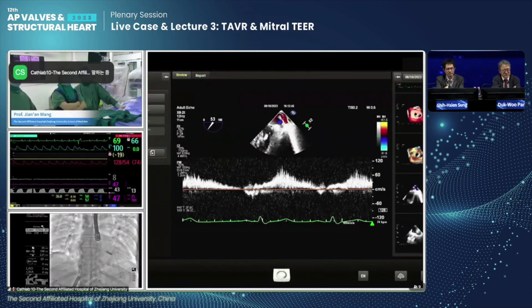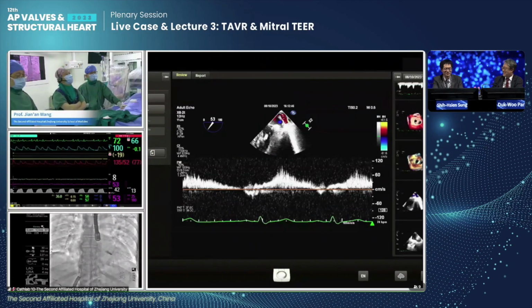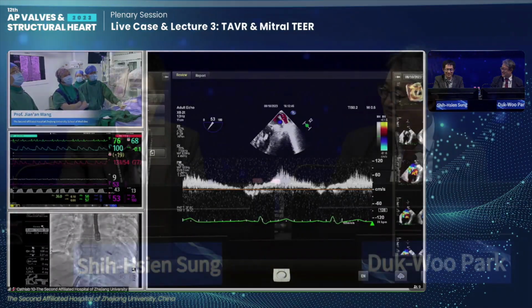Actually, just after the professor's presentation, we already finished the case. Okay, thank you so much. Congratulations for a very successful case. We saw that the treatment using the Dragonfly to treat the central lesion is quite impressive. Thank you. Congratulations.